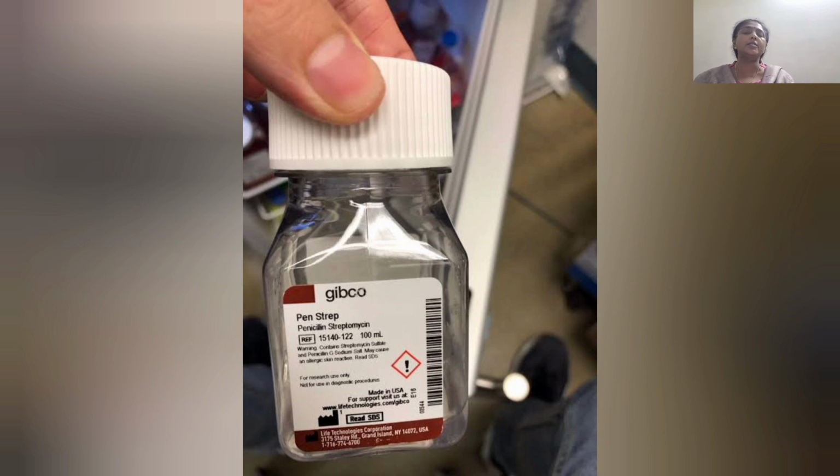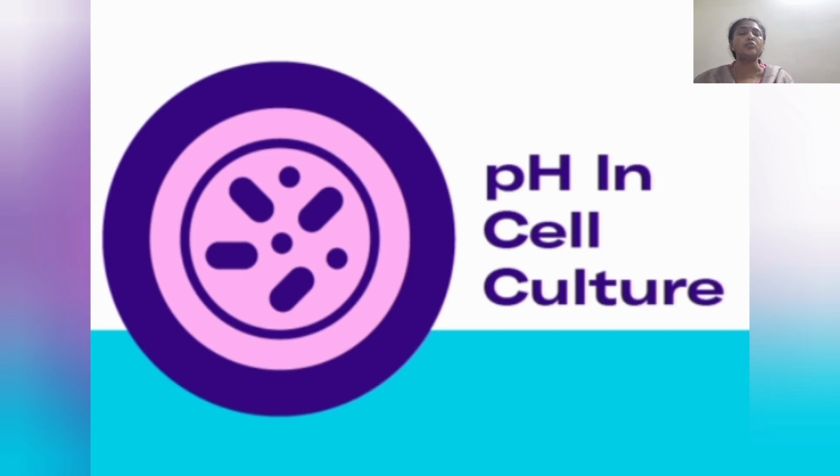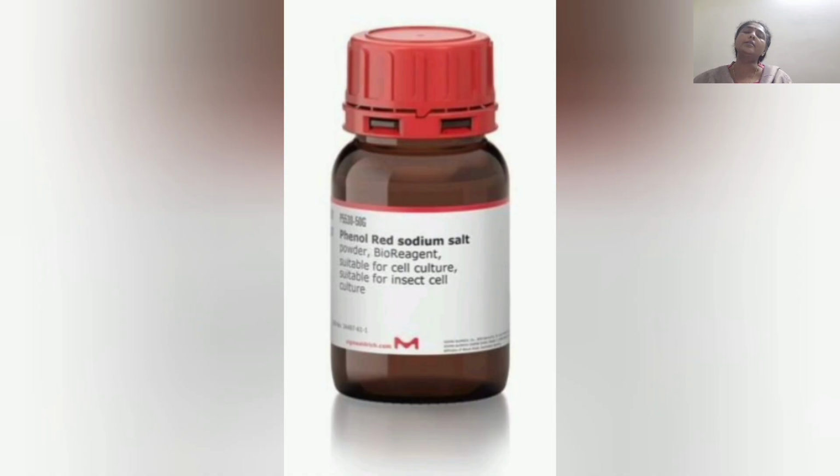Antibiotics is another essential component of media, and usually penicillin and streptomycin is used to prevent the growth of bacteria and fungi. pH is very important in cell culture, and cells grow well at physiological pH of 7.2 to 7.4, 37 degrees centigrade temperature, and 5% carbon dioxide.